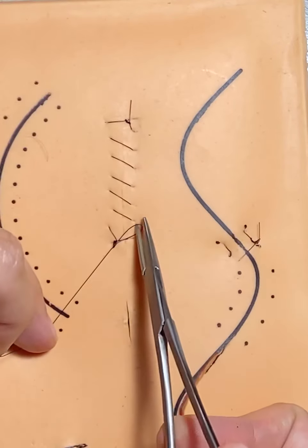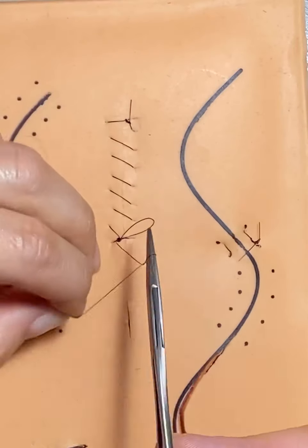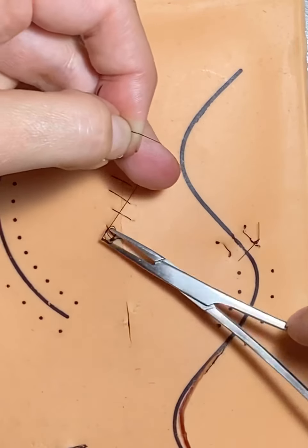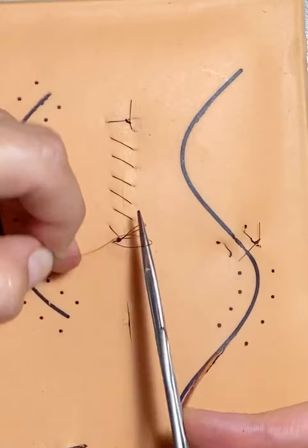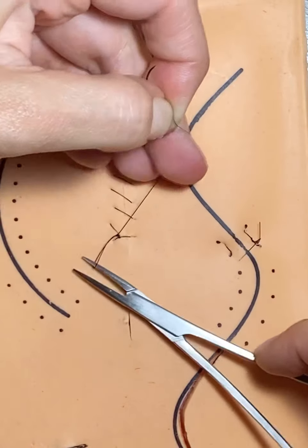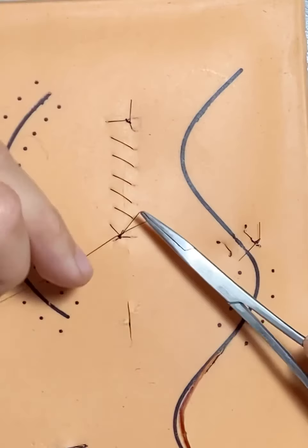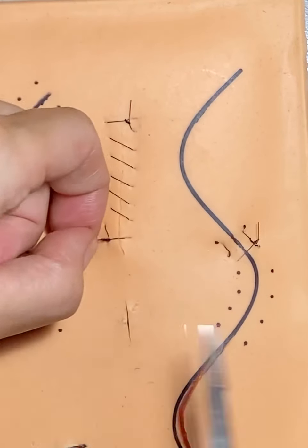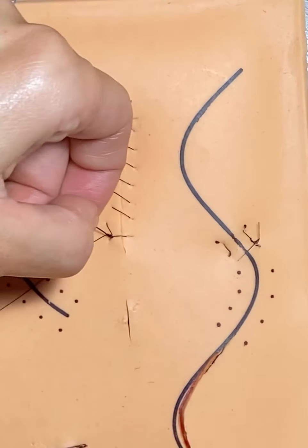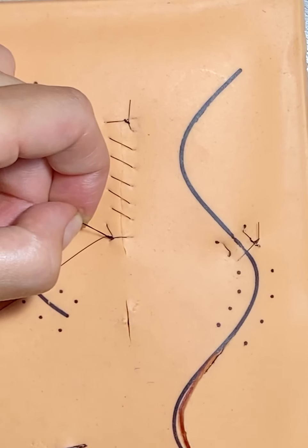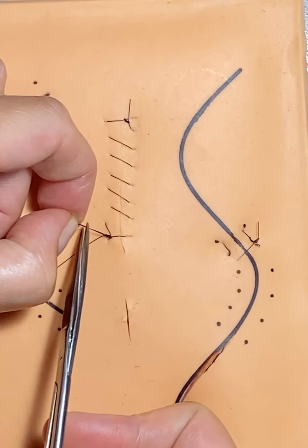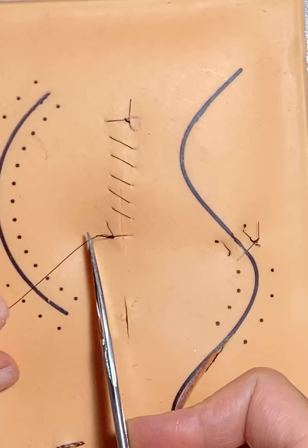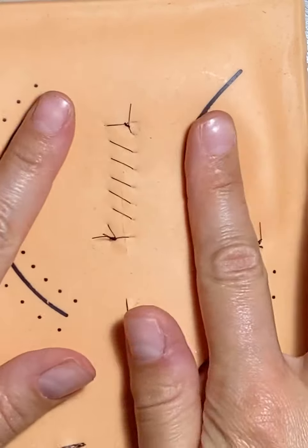I think that's number four and we'll do an extra two because we only have two knots holding this whole thing together. Five and six. And then we're going to cut our tail and our suture line at the end at the same length. And there's your baseball stitch.